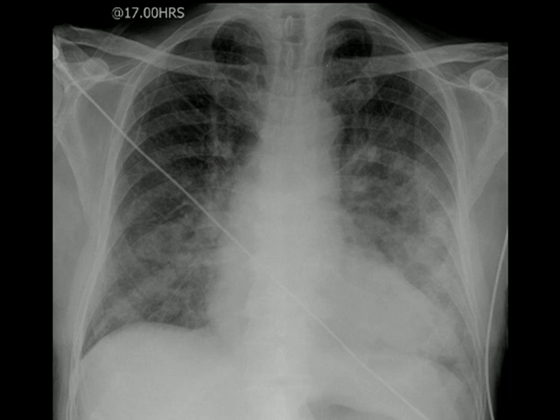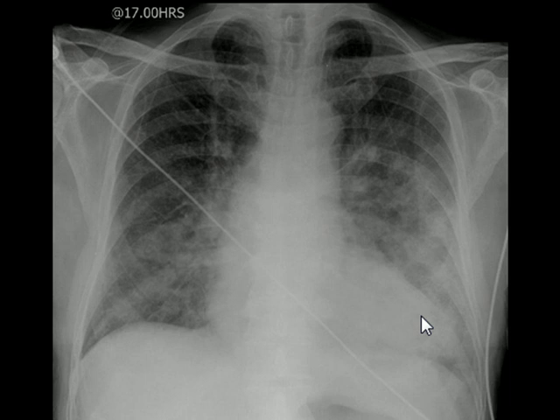Chest X-ray is a very important diagnostic tool in pulmonary edema. As described before, fluid first enters the interstitial space, which becomes visible as septal lines including Kerley A and Kerley B lines. However, septal lines may become difficult to see when edema enters the alveolar space. The radiological presentation at this stage would be diffuse haziness across both lungs indicating consolidation, which can be difficult to differentiate from bronchopneumonia and other conditions. However, the patient's history will guide you to the correct diagnosis. In pulmonary edema, you may see the so-called batwing or butterfly sign, where the apices and bases remain comparatively aerated and consolidation diverges from the hilum to the periphery of the lungs, creating a butterfly-like or batwing-like sign.